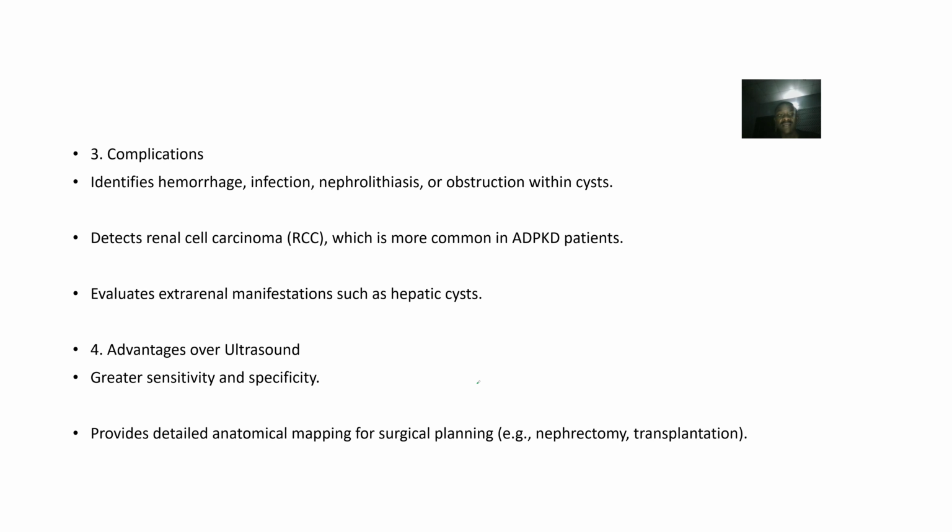Complications. You can identify hemorrhage, infections, nephrolithiasis, and obstructions within the cyst. It detects renal cell carcinoma. Okay, so it's more sensitive than ultrasound, it's more specific than ultrasound. It can give you a more detailed anatomical mapping than ultrasound.